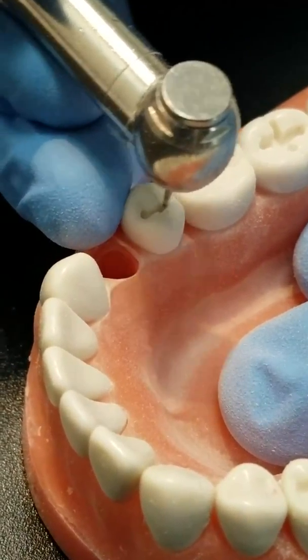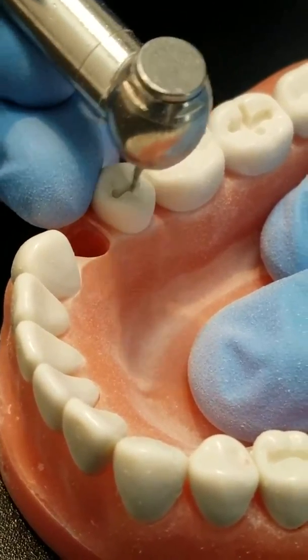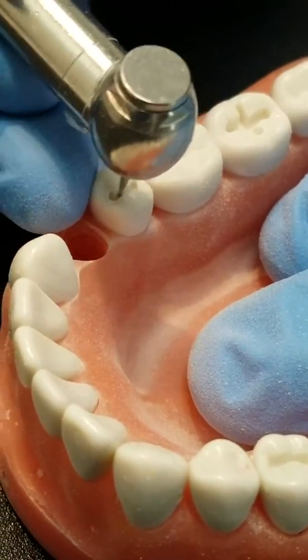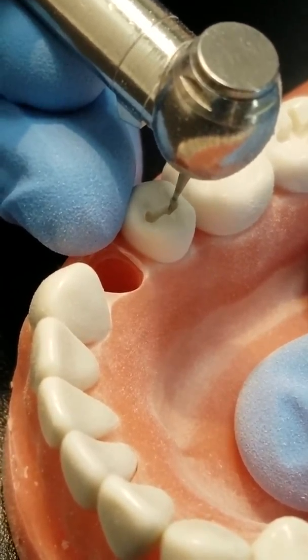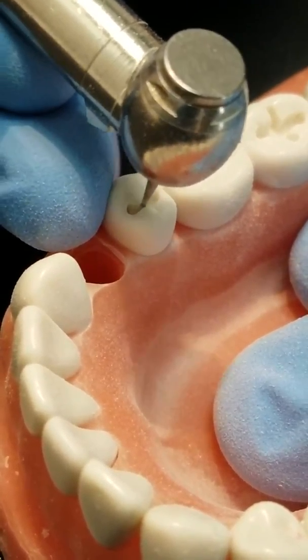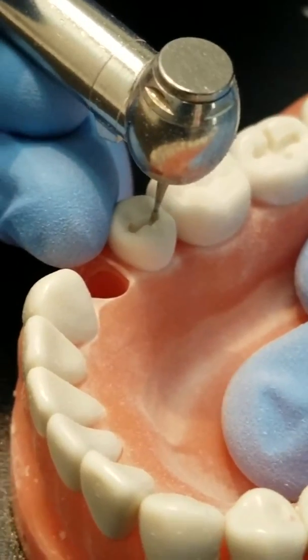You can hear me actually hit the wall a couple times here and the handpiece will actually slow. All I'm doing is tracing back and forth, slowing down with the high speed handpiece, taking out any chunks that might be sticking out, making that floor nice and smooth and keeping it parallel with the tooth so that I get that converging wall — the 6 to 10 degrees that you're supposed to get.